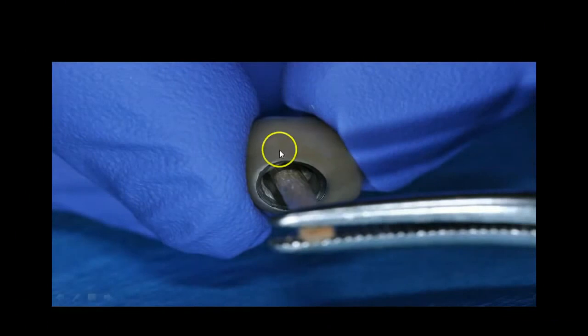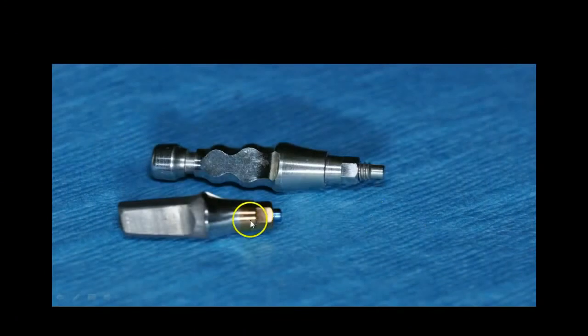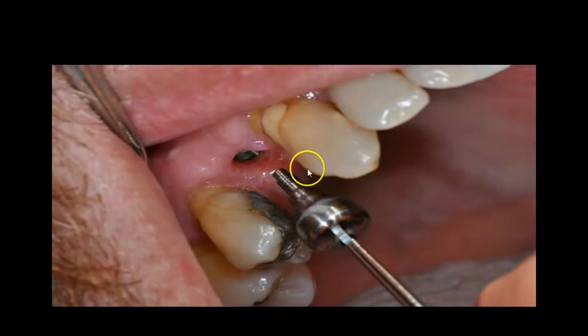All right, now, how are we going to remove that cement like we talked about? Break off one of those Q-tips, get the little wooden stick there, a little pin or toothpick, whatever you have. Put some blue mousse material inside the actual crown itself, and we're going to make a custom die. All right, once that sets up, you remove it, and what do you have? Again, you have a custom die for the inside of the crown. So why are we going to use that? Once we actually mix up the cement, we're going to use that die to remove the excess cement.